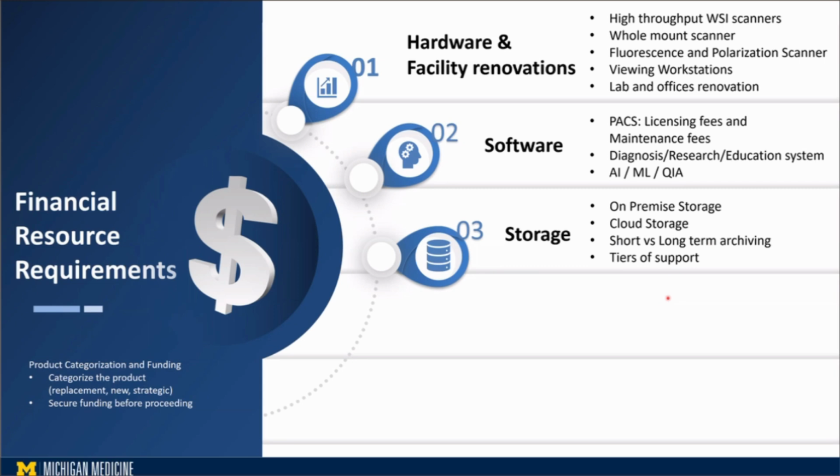I'll share with you one of the challenges, which is the financial burden. When we created the 10-year plan for the transition, the billing came back for storage at about $39 million for 20 petabytes on-prem. And that was a really insane amount of budget for just storage. This is nothing other than storage. So we decided we do not need this amount of petabytes to go live at this moment. All we need right now is maybe 2 petabytes to start the project.